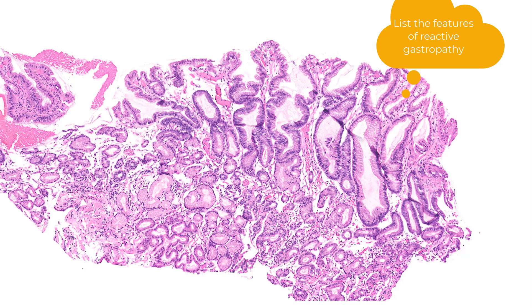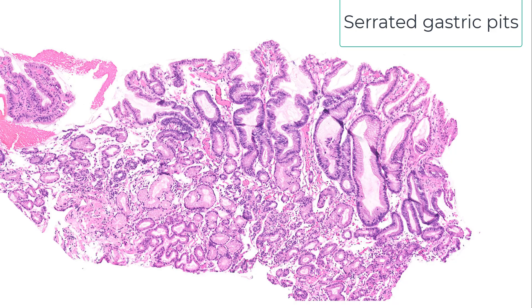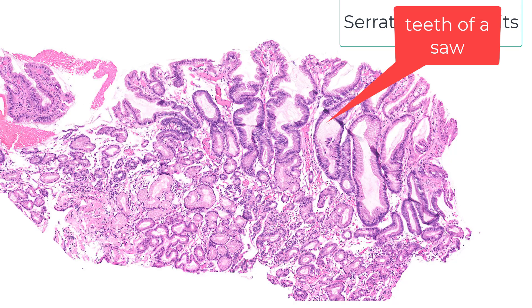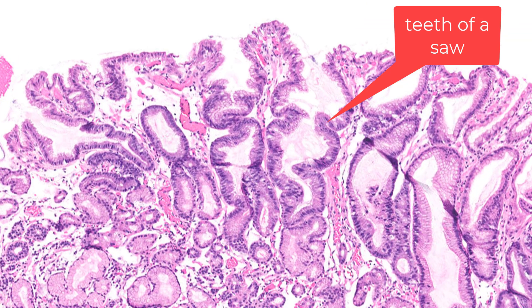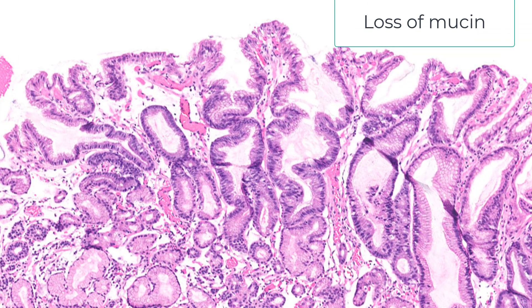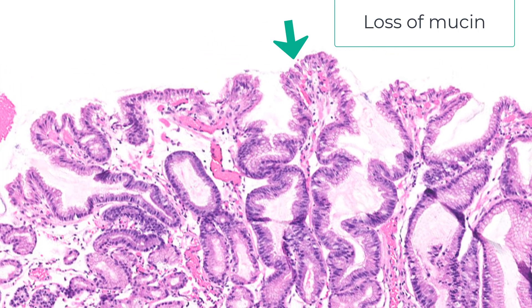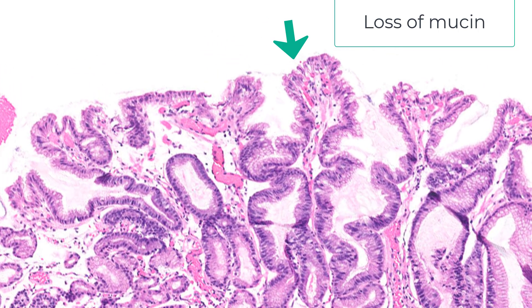Let's list the features. Feature number one is the serrated profile — notice these saw-tooth-like profiles. Feature number two is loss of mucin; those apical cups of mucin have virtually disappeared.